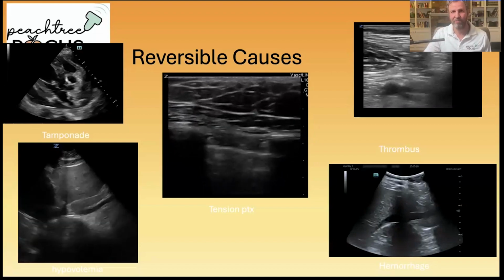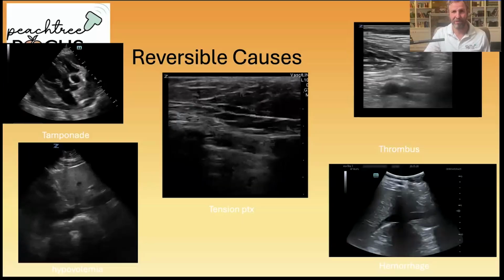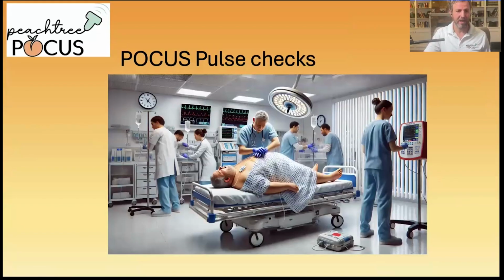So the ultrasound gives us the ability to narrow in on those H's and T's at the bedside, even if we know nothing about the patient's history, which is very common in the emergency department where I work. Now let's talk about POCUS pulse checks.